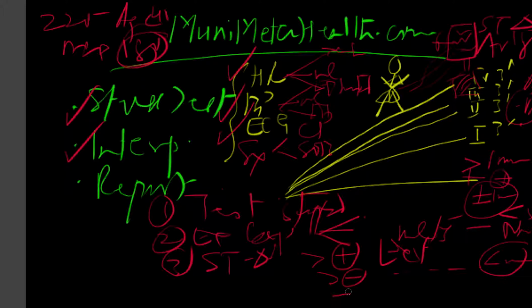Now, as I said, very rarely, like less than 5%, you'll write a non-diagnostic report and say, look, this person had a non-diagnostic, equivocal response on an ECG. So in a nutshell, all of these parameters are taken into account.